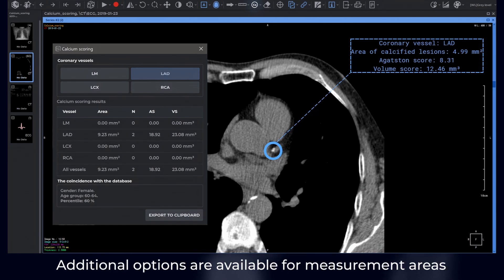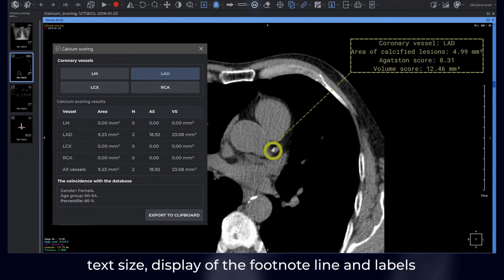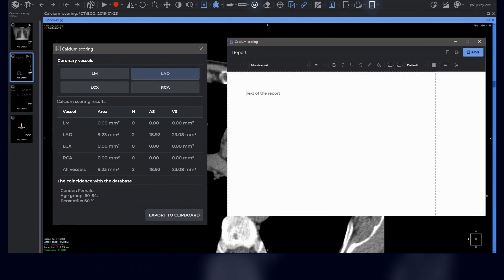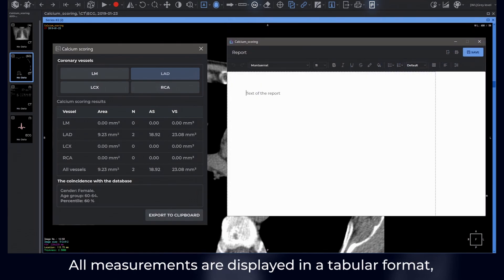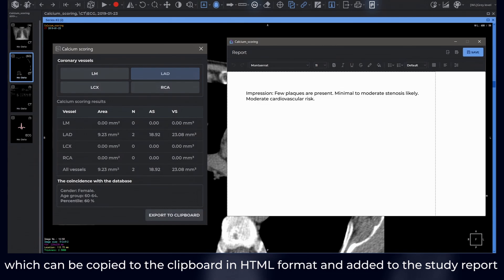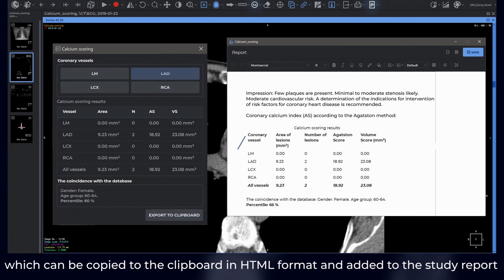Additional options are available for measurement areas, such as changing names, colors, size, line thickness, text size, display of the footnote line, and labels. All measurements are displayed in a tabular format, which can be copied to the clipboard in HTML format and added to the study report.